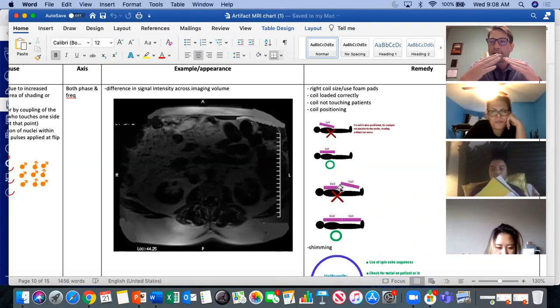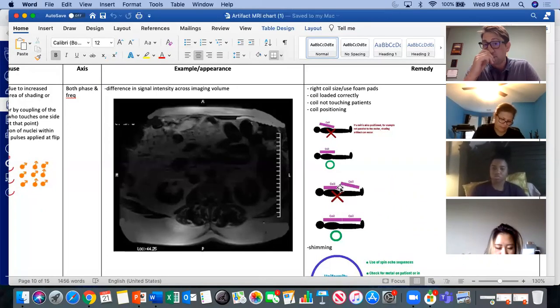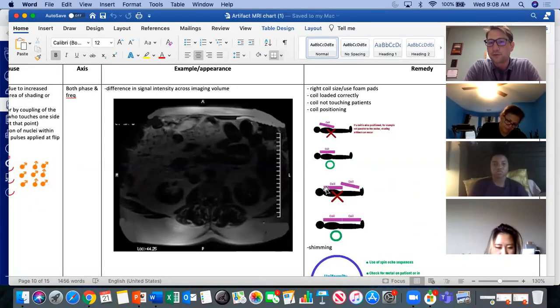We know that we typically sometimes have to use 2 abdomen coils if we're doing like an abdomen pelvis. So if you've been in a hospital or a clinical site where you have to do the abdomen and then move down to the pelvis, typically we have 2 abdomen coils to cover from the top of the liver all the way down to the pubic symphysis. It's important that we do not overlap these coils so one's a little bit higher than the other.